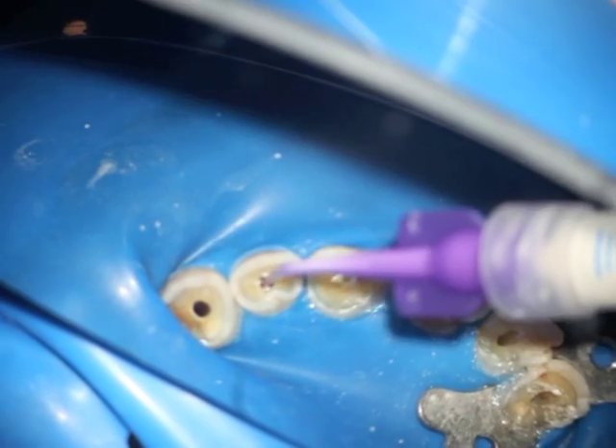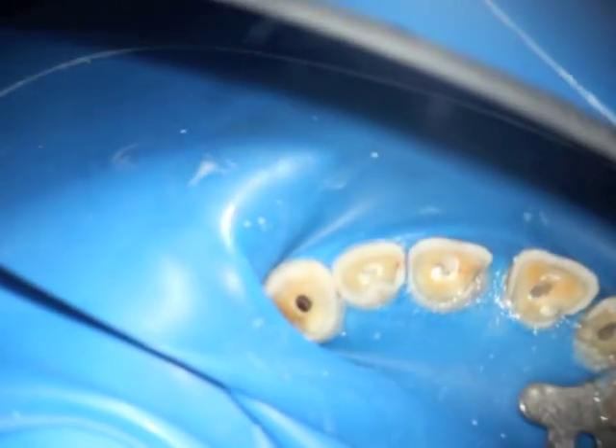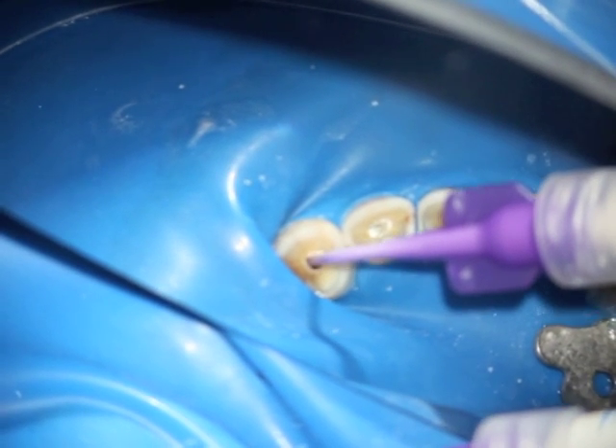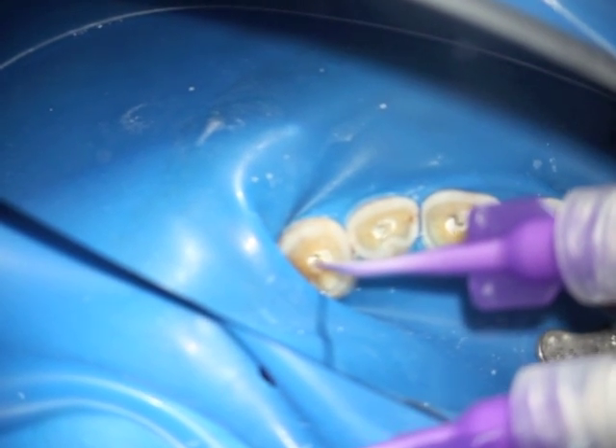It's important not to create an overfill. This comes with some experience working on extracted teeth and getting a feel for the flow of the bioceramic sealer, and learning how much of the material to place in the canals.